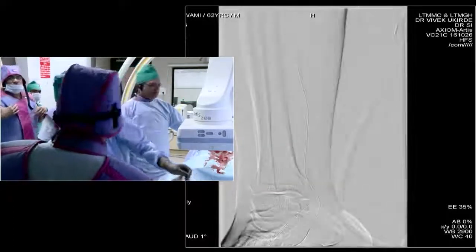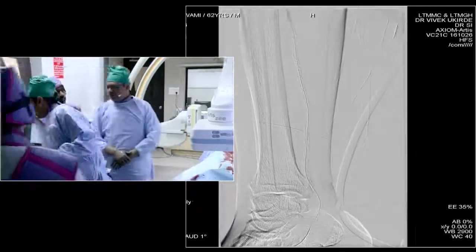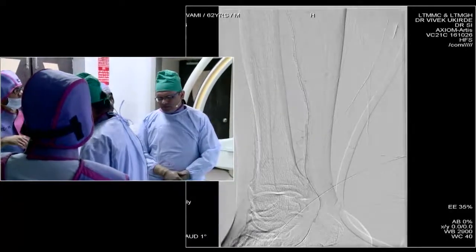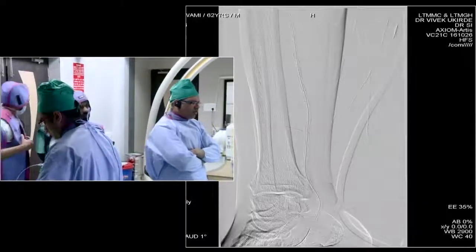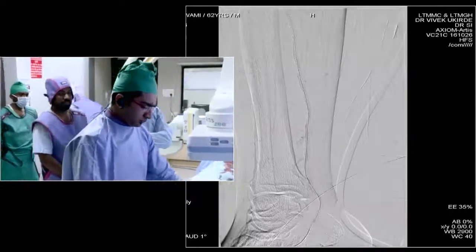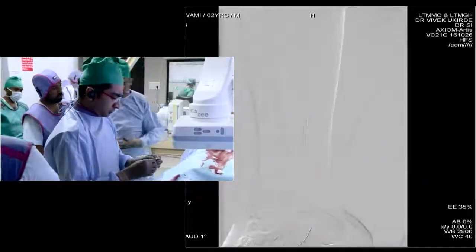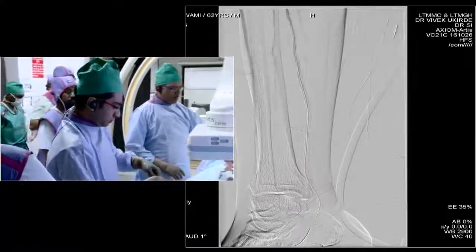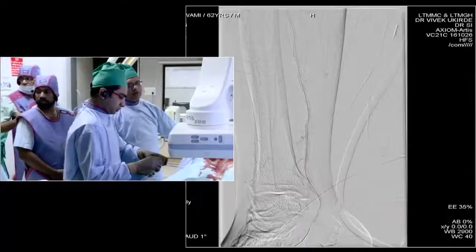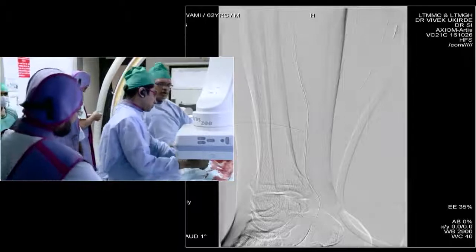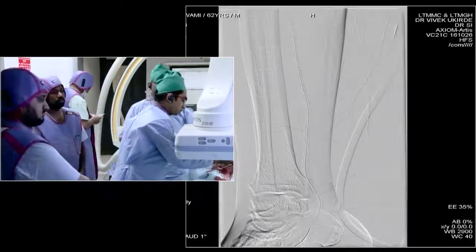I'll take a four French catheter and take a run. Do you use vasodilators like NTG or nimodipine? When we are doing below-knee cases, we always have nimodipine flush going on from the sheath. How much heparin have you used? We gave 5000 units of heparin. Most of us use the same. The patient is already on anti-platelets; if the procedure gets prolonged, we repeat 1000 units of heparin every hour.